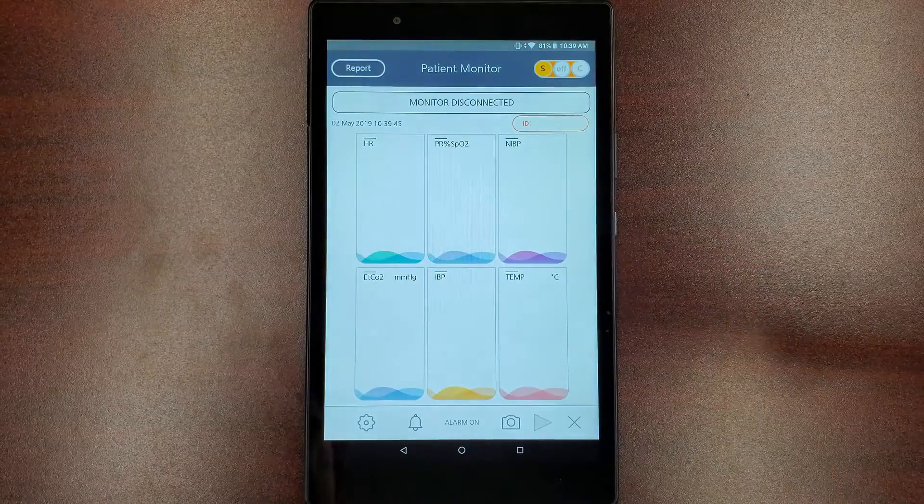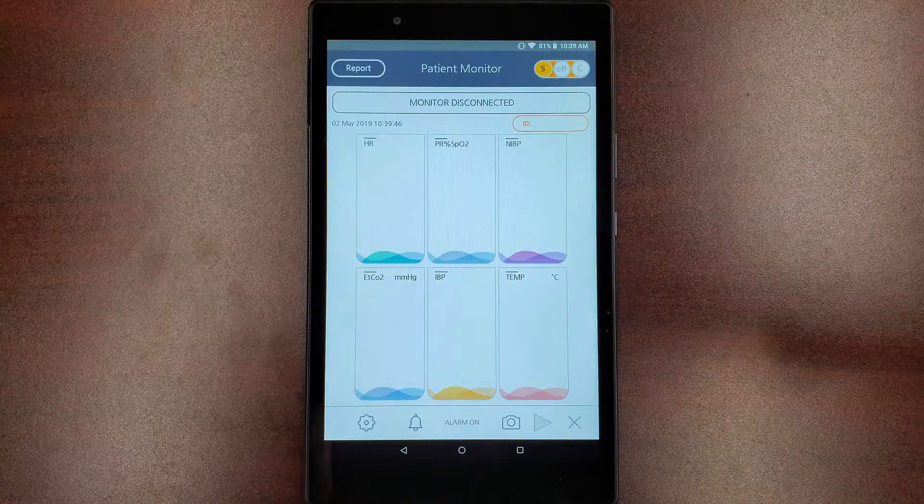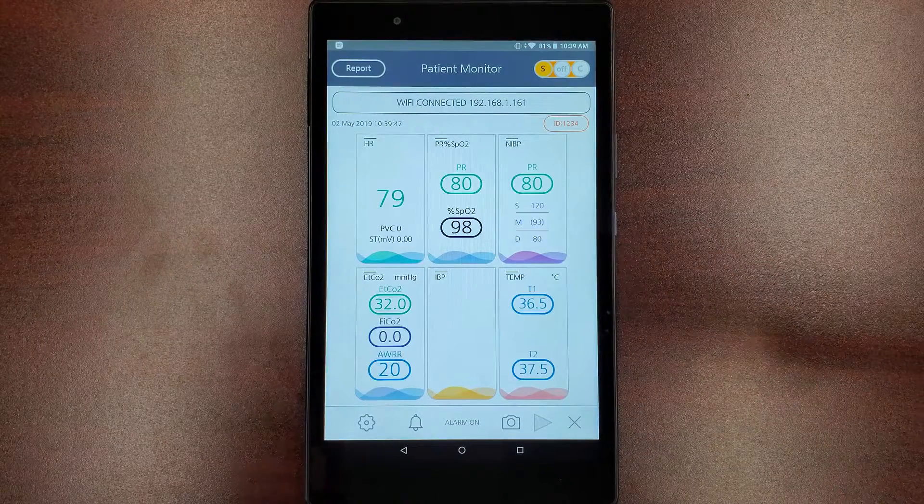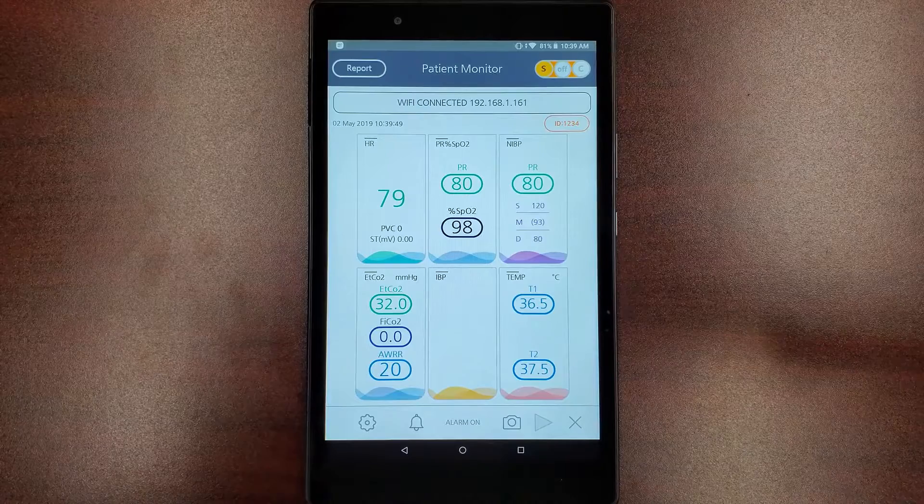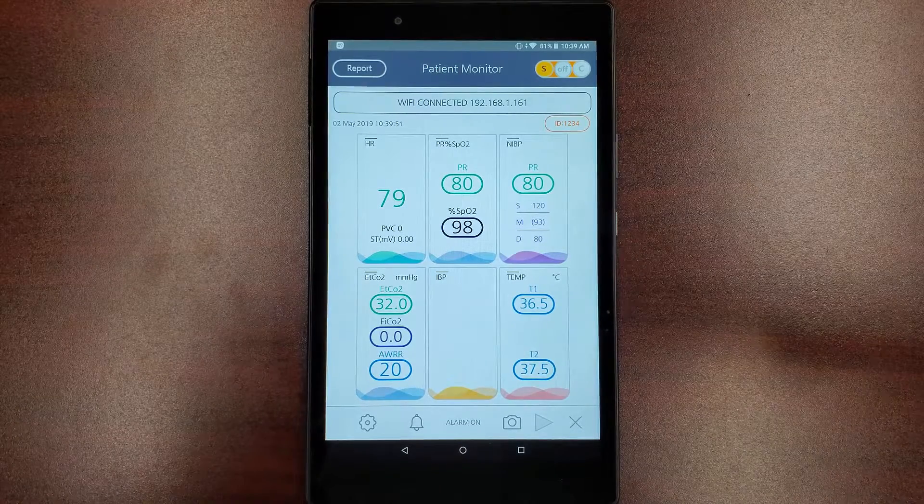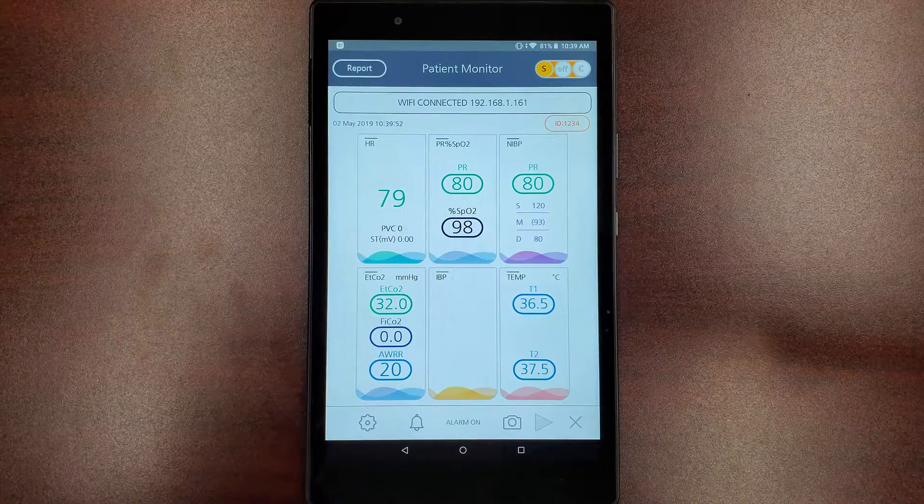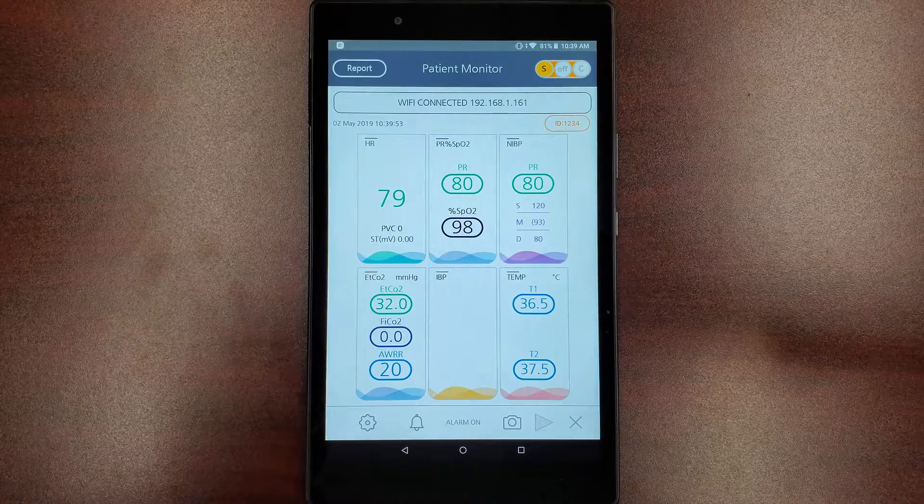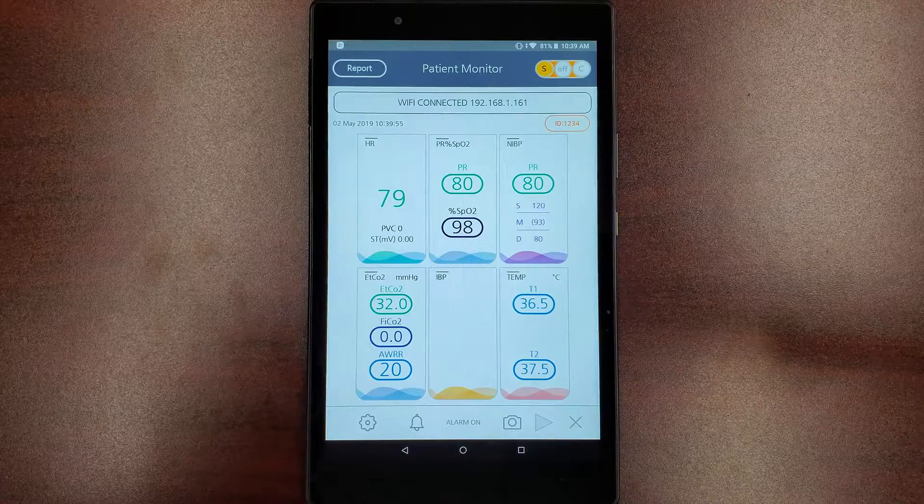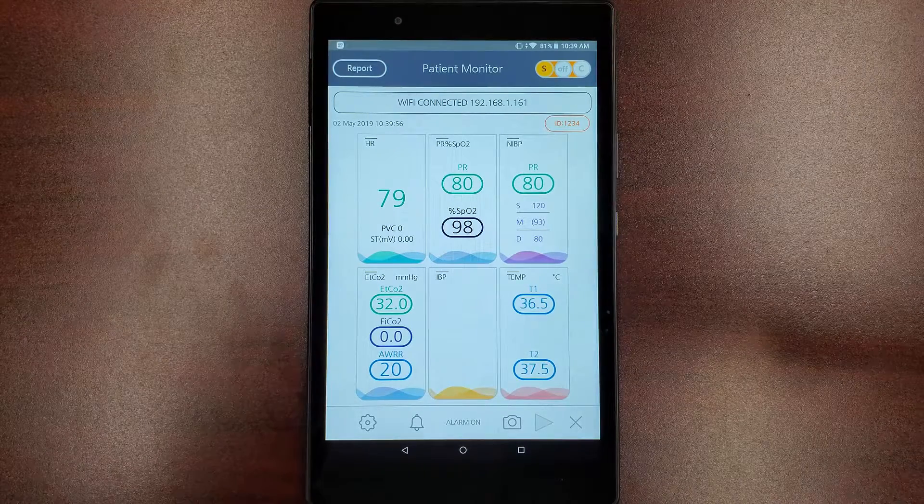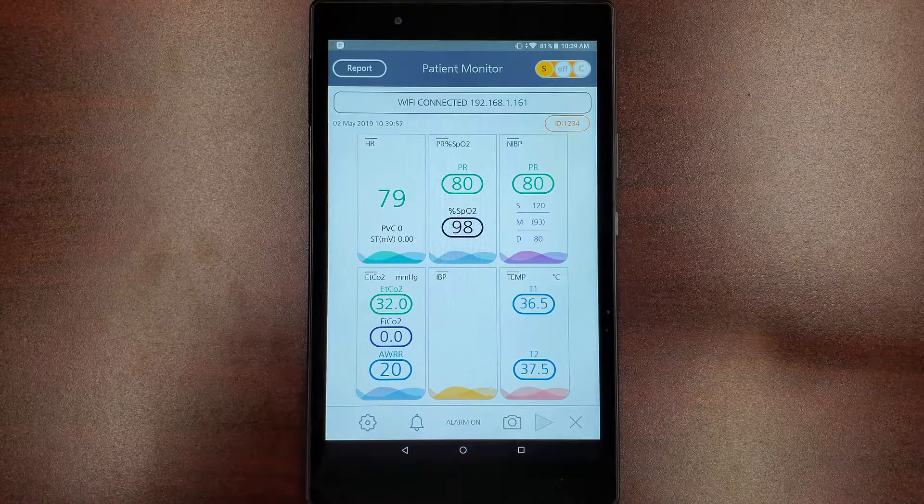You have now connected your Bionet patient monitor and BT Link mobile in server mode. To connect additional monitors to your mobile application, repeat the steps of inputting the host IP into the additional monitors.